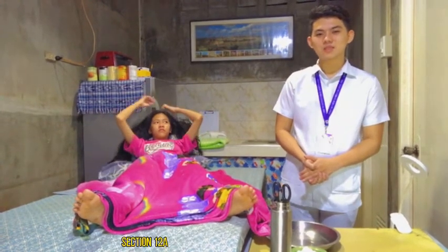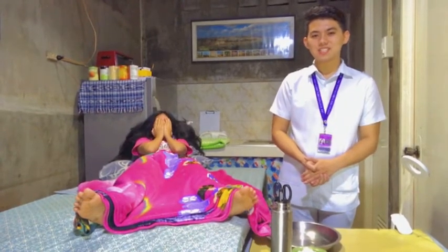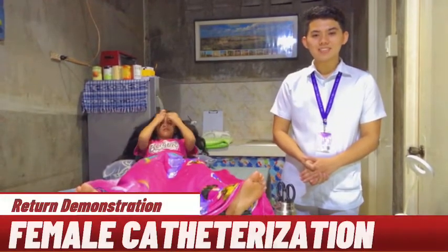Good day everyone, my name is Kenneth D. Velasquez, Section 12A, Group 4, and a student nurse from Davao Doctors College. Today, I will be showing you my return demonstration in performing female catheterization.